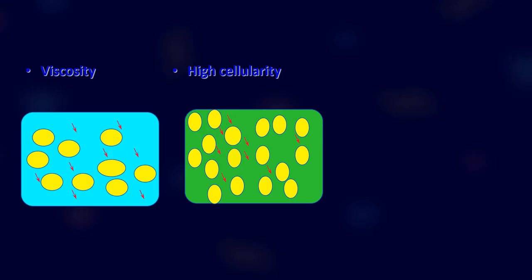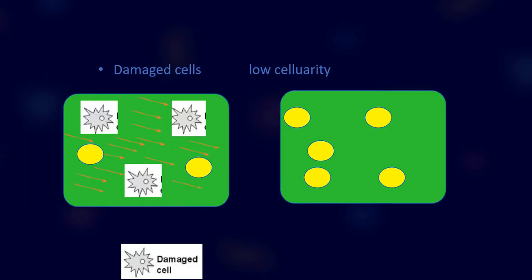Lastly, when the tissue shows hypercellularity, as in malignant or high-grade tumors, the diffusion will be restricted.